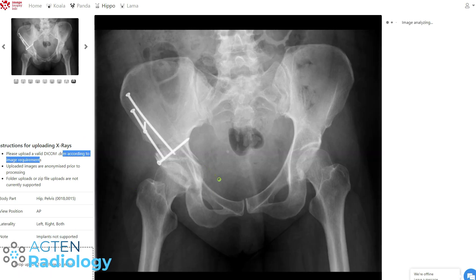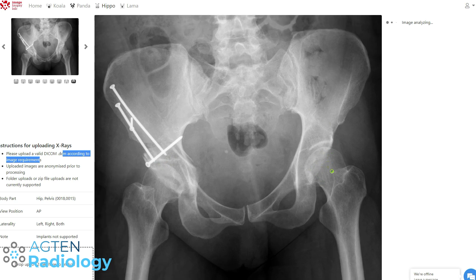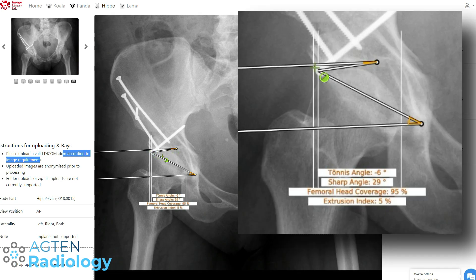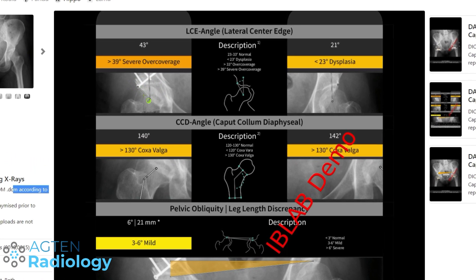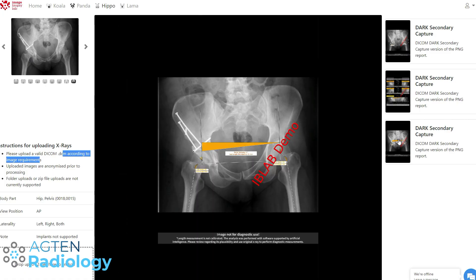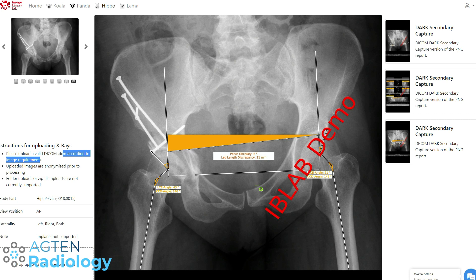So this next case is special: technically it's not an arthroplasty, but they did a periacetabular osteotomy (PAO) for a dysplastic hip. On the left side the hip joint is dysplastic — not enough coverage — and it was the same on the other side, but they used screws to rotate the acetabulum for better coverage. We'll now see how the algorithm deals with this. It seems to be picking the right spots. On the left side it shows dysplasia; on the corrected side it shows over-coverage — which is the intention of the surgery. The algorithm may handle the metal explicitly since it's very dense.